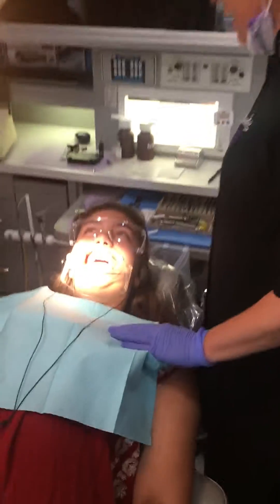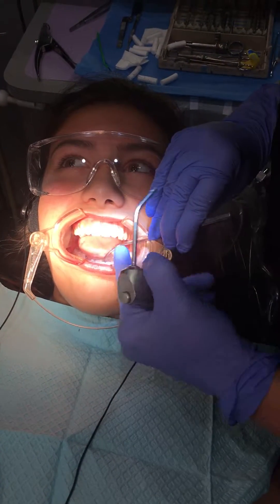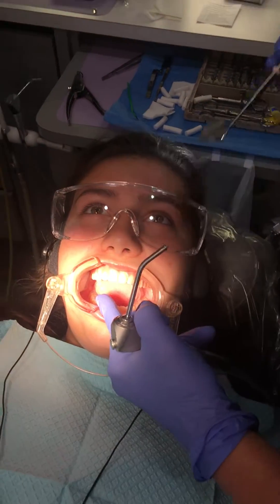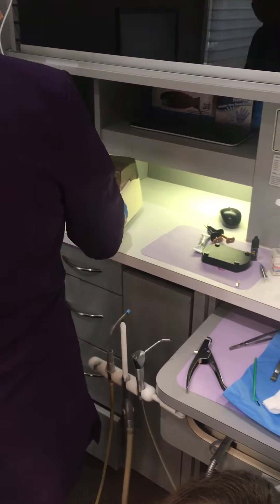So we're here today, we're just going to dry Tori's teeth and place some sealants. Open big, Tori. We're going to place some sealants on her molars and you'll see how fast and easy it is. Go ahead, Missy — she's going to mix the sealant material. The sealant has some super fluoride in it.